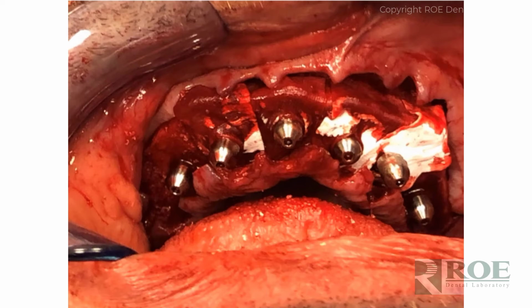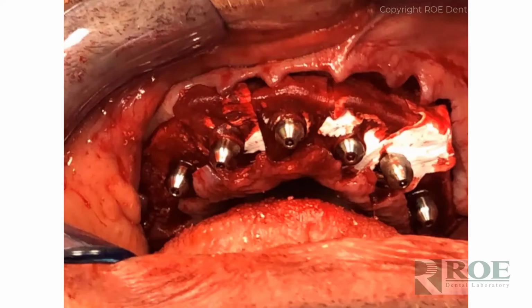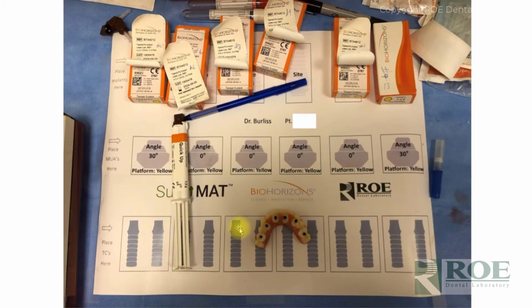We're developing a system now for an extraoral conversion, where you'll just pick up the rapid appliance and you'll do the prosthetic conversion outside the mouth. Developing that now. It's very exciting. But once you've picked up both, remove the prosthetic, go through the normal procedures of suturing, putting comfort caps in, and finishing that. This prosthetic has been removed.